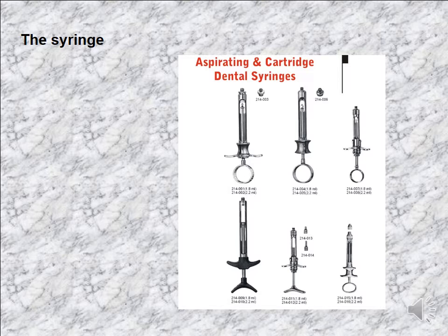apparatus. So when we name this instrument as a dental syringe, it is not an ordinary syringe that is used by the physician or sub physician, like the male and female nurses who give injections by normal syringe, but it is a dental syringe.